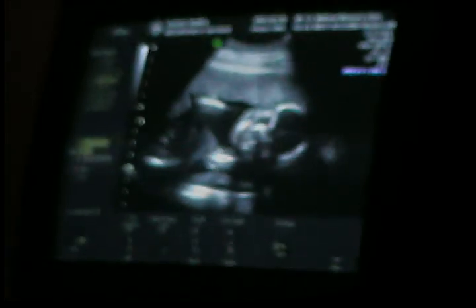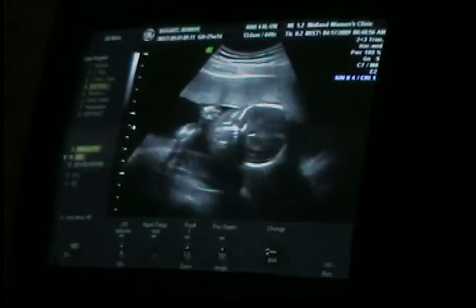I'll look in a little bit. Okay, but there's the legs. Right here. Kind of resting right now. I don't see him moving. I want to make sure nothing's wrong with him. No, that's a normal heartbeat. I'm saying he too. All right, let's see here. So our head is indeed down.